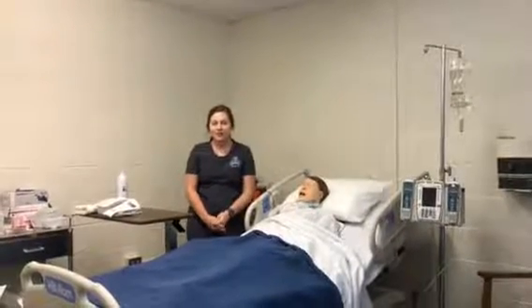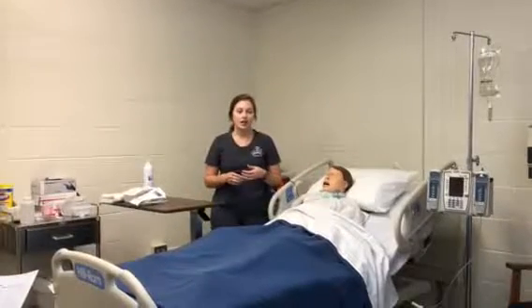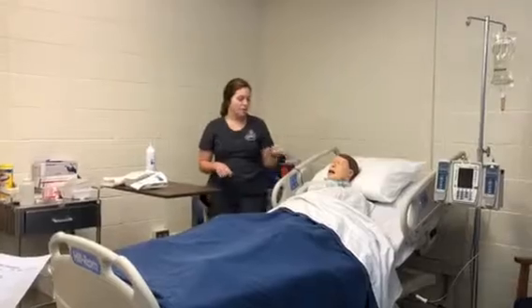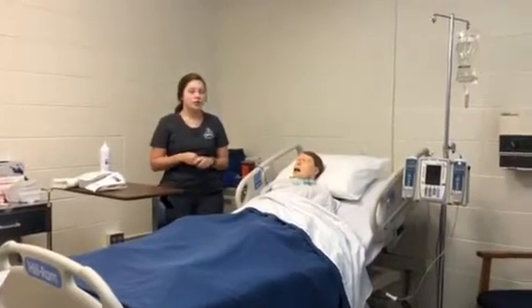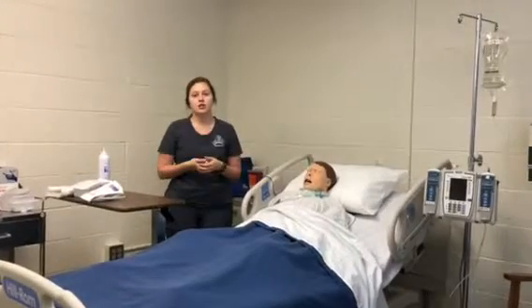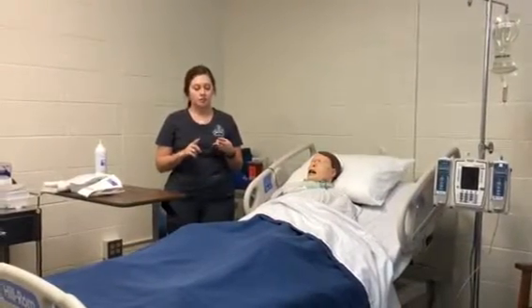My name is Mackenzie VanderFeltz, and today I'm going to be showing you how to do trach suctioning and trach care. Let's go ahead and get started. So I have my patient here. I have already assessed him. Really all you're just looking for is to make sure that we do need a complete trach suctioning and trach care.